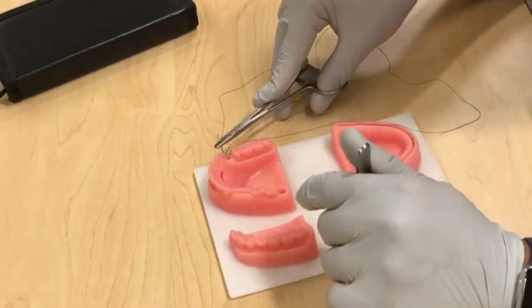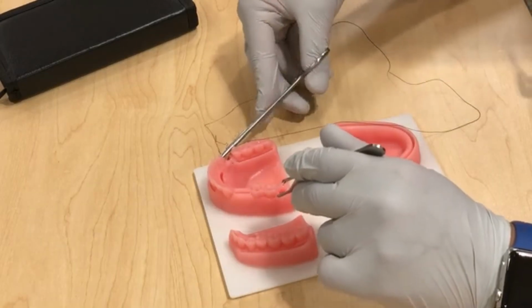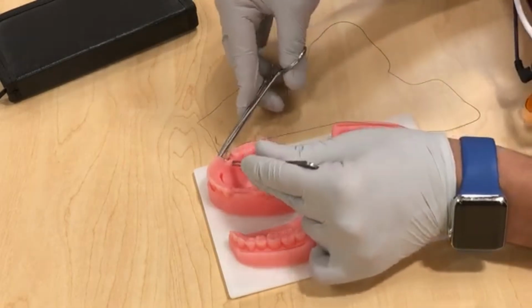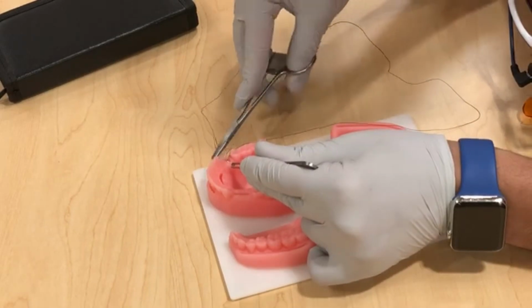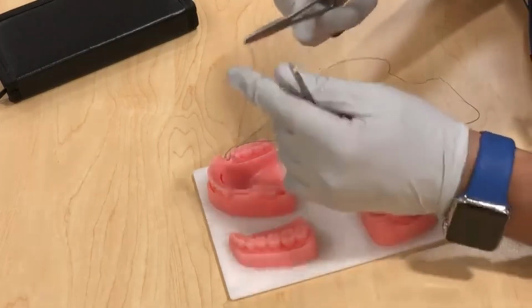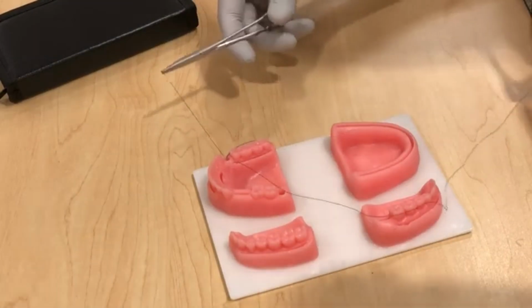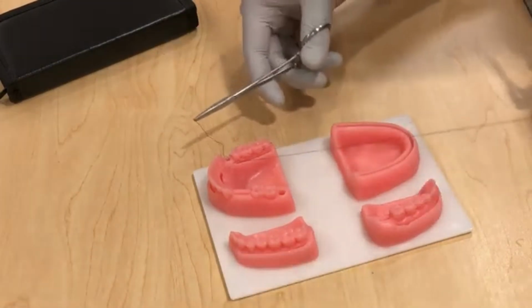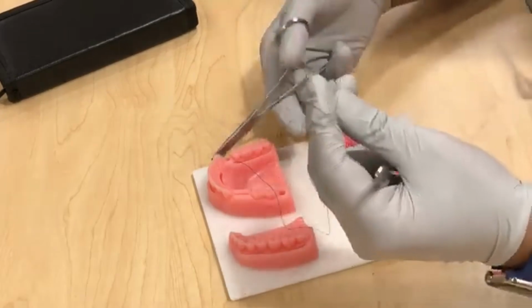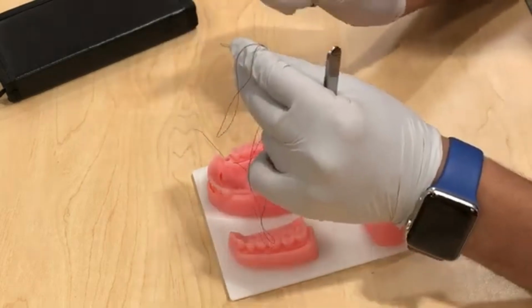Okay, and then again you would want to hold it the same way. So you'd want to go again at almost 90 degrees to the incision or flap. I would hold the soft tissue with the tissue forceps to hold it still, and ideally you'd want to make it symmetrical to the other side. So if you enter 1.5 to 2 from the incision, you would want to mimic that on the other side. So I would hold this to not lose it, and have it about an inch. And then I would try to keep the needle in my hand so I don't lose it and it doesn't hurt anyone.